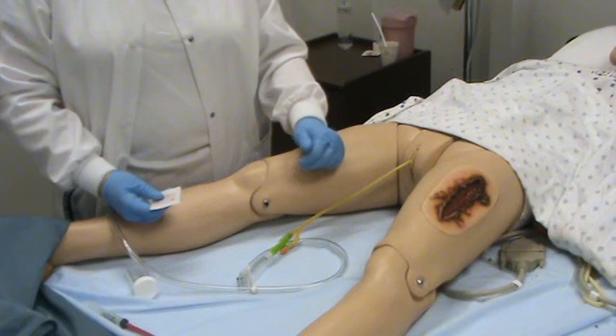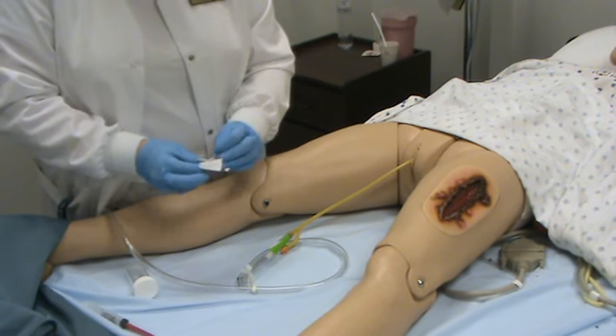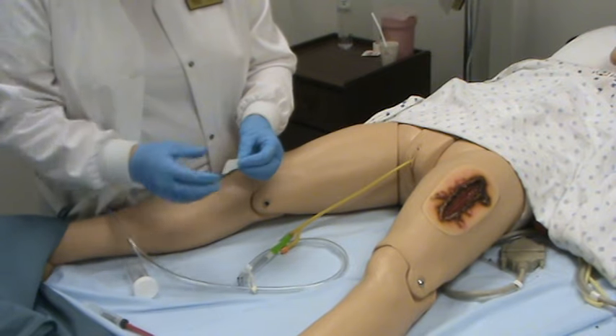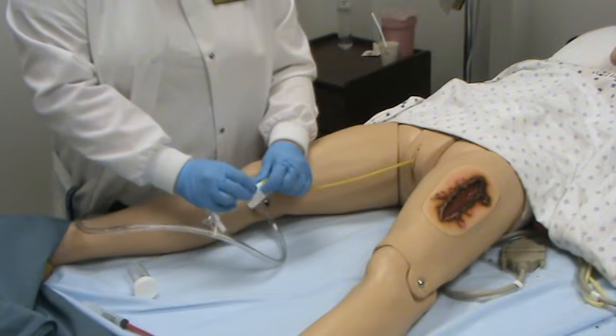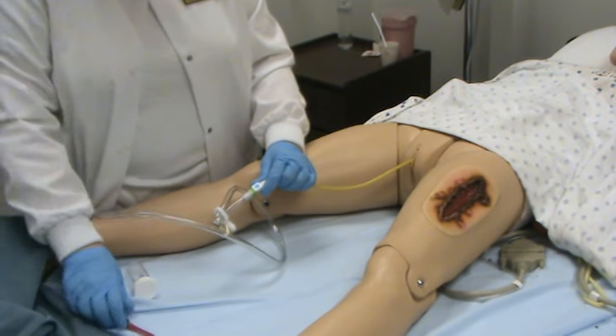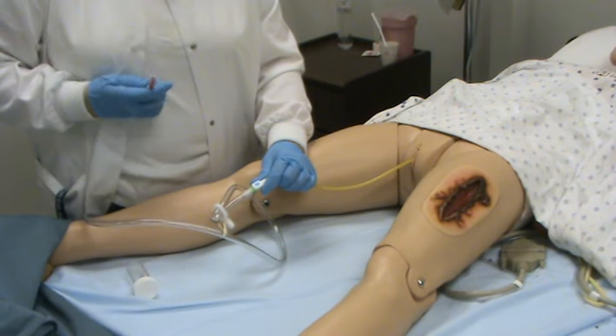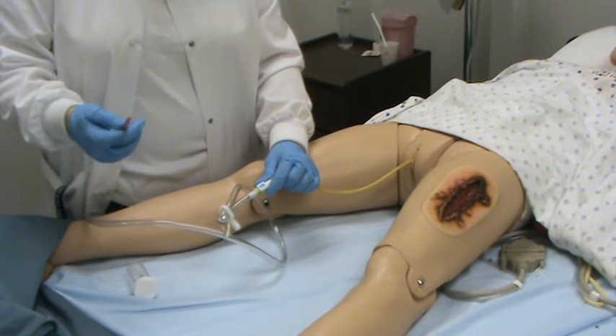Do not let it go any more than about 30 minutes. Once you see urine in the tube, open up an alcohol wipe and wipe that surface using circular motions. Let it air dry for a minute, then take a 10cc syringe with a 25 gauge needle on it.